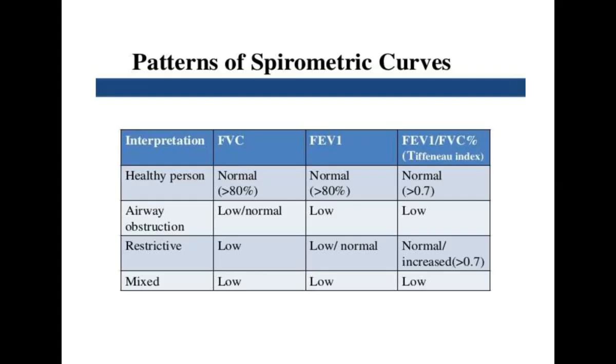Mixed has a low forced vital capacity, whereas the forced expiratory volume in 1 second is also low, and the ratio is also low.